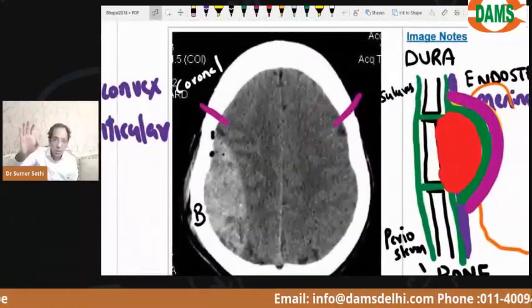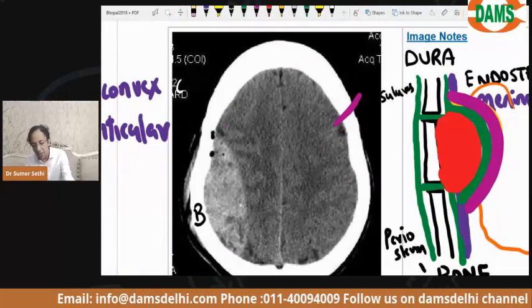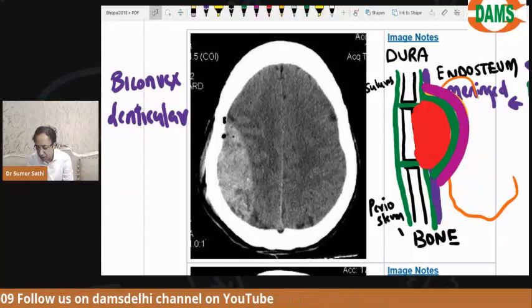And we need to know EDH. Beta, this image is asked every year in one of the exams. Aana hi aana, beta. EDH to aega aega, beta. You cannot do it wrong. It is definitely going to be asked, beta. It's a surgical emergency, beta.